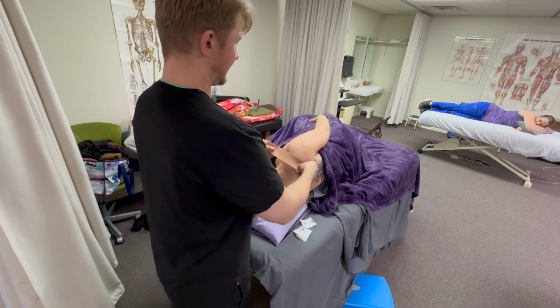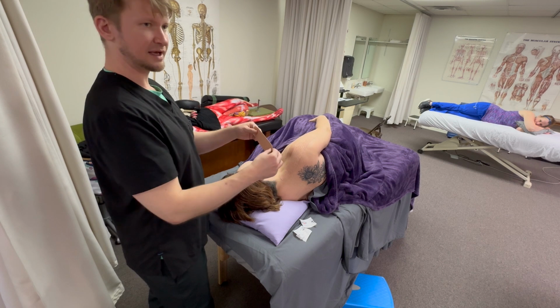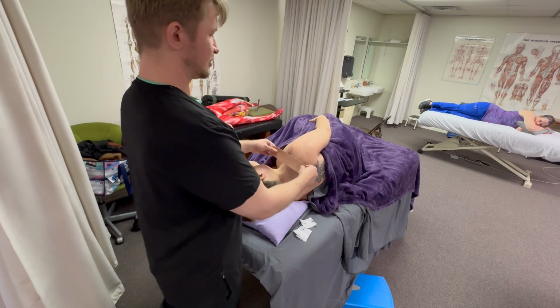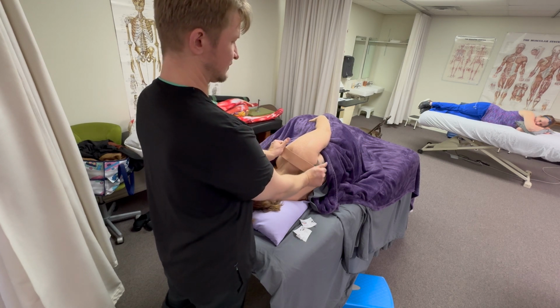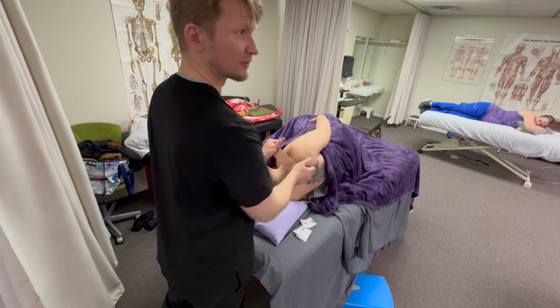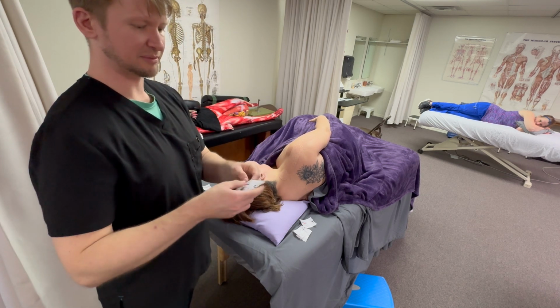So the next one, here I have to decide, is that going to be too long? Now, I can adjust it down. This doesn't have to be perfectly uniform. So I could shift it back like this and let this tape come further down onto the back. So this is the other way we could apply this.